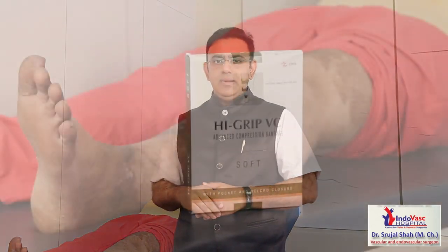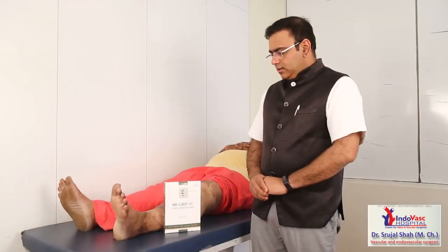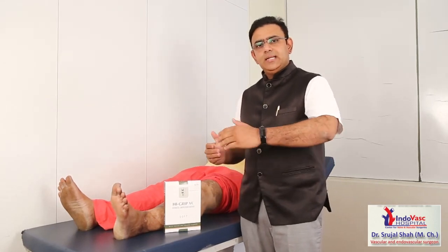In cases of venous ulcers, once we treat them, we recommend bandages. Bandages are of two kinds: short stretch bandages and long stretch or elastic bandages. Today we will be showing you elastic bandages.